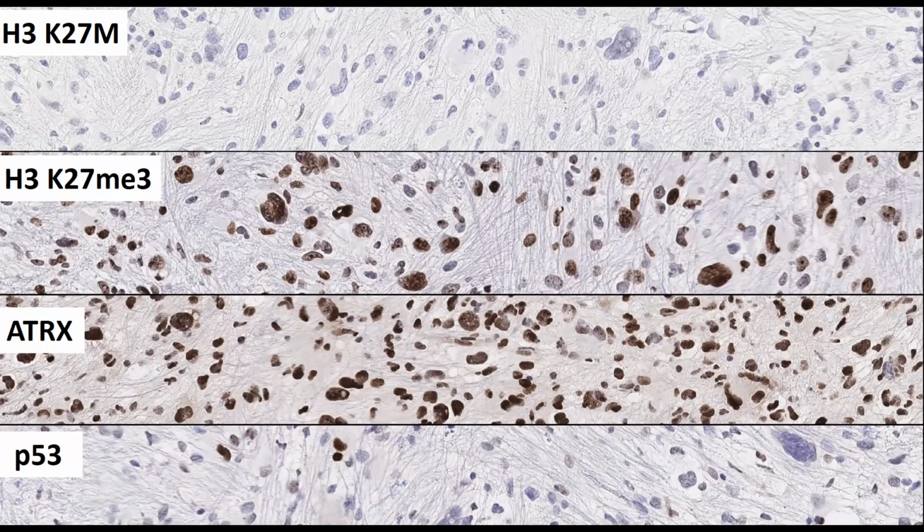All right, now we go to the molecular signature immunophenotype, surrogate immunophenotyping. We're looking at protein as markers for the genomic alterations, whether they're there or they're not, wild type or altered. So the first is histone H3, H3.3K27M, H3K27me3, ATRX, and p53. It is critical that the oncologic pathologist know whether the antibodies used against these targets are directed against the normal wild type protein or against an altered mutated protein.